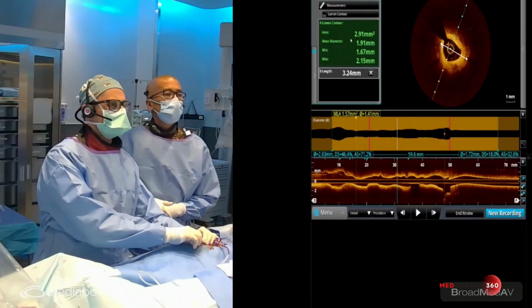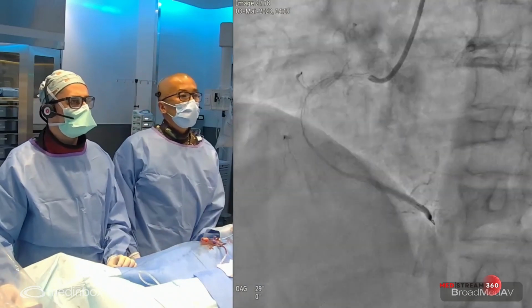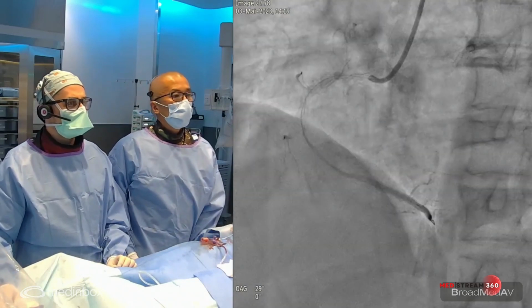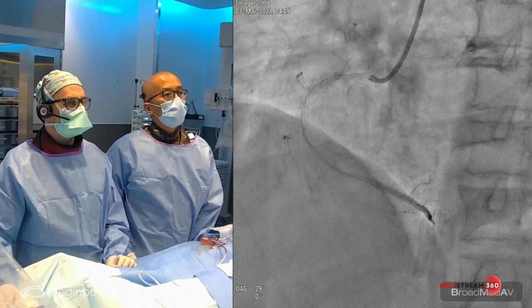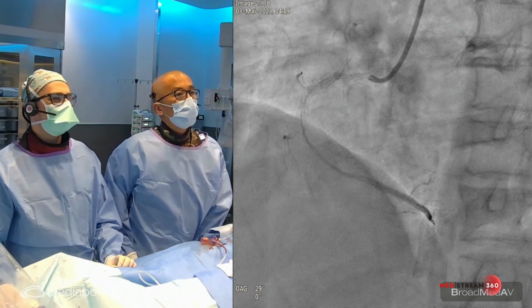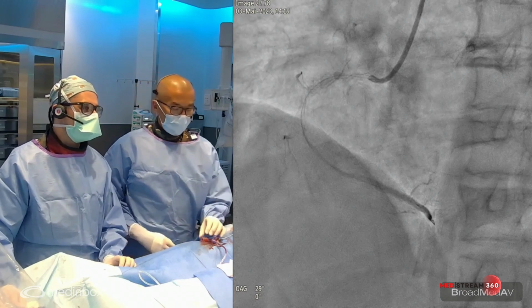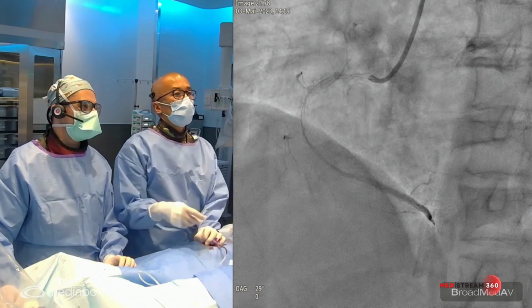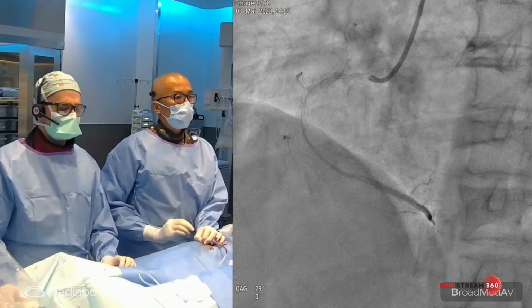The 20 millimeter, yeah. So this is in-stent also more towards the distal aspect. So you saw proximally and maybe a bit before the 18 millimeter mark. So the lumen is actually really narrowed. Yeah, and it looks homogeneous. Yep. So this is the hallmark of intimal hyperplasia, but there is a bit of neoatherosclerosis at the outflow of the stent. So you see the stent, so we're clearly still in the stent.